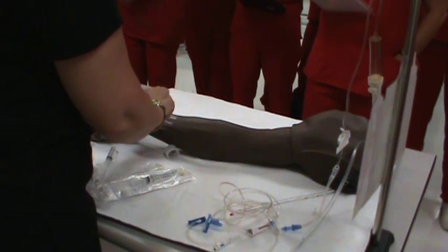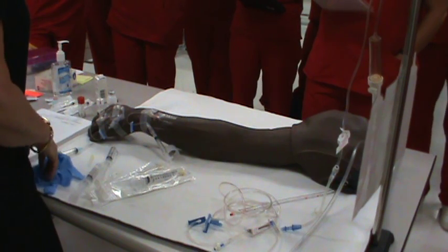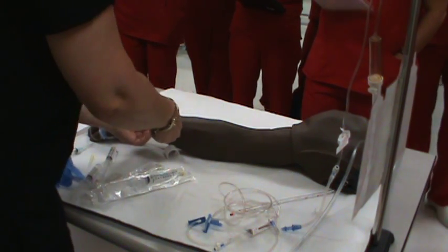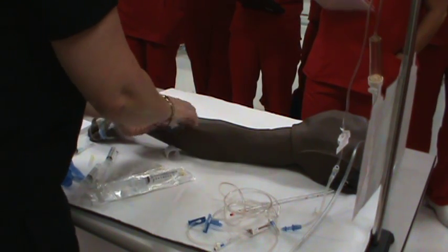Okay. So you wouldn't use a saline lock before? Well, if you had saline, you flush? We always flushed it first. Yeah, I flushed it first. With the child, you would flush it first because you're checking for patency.